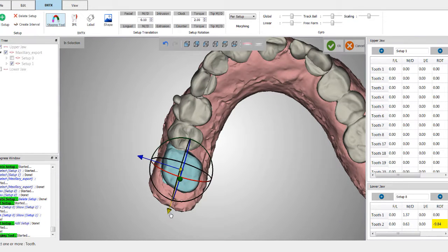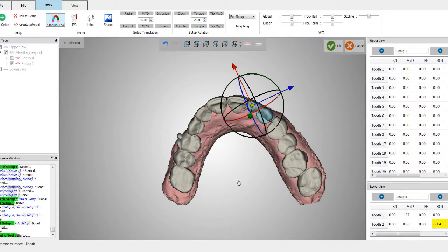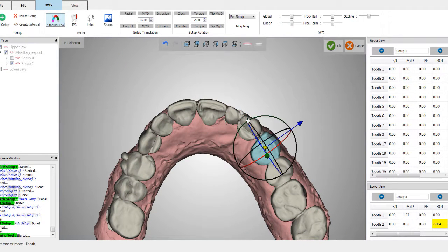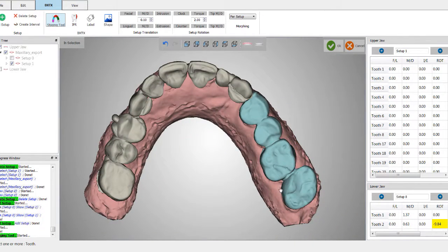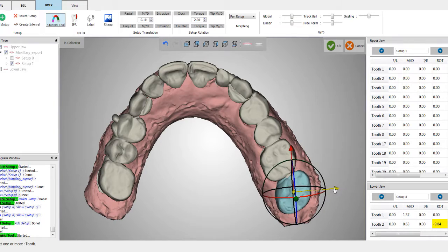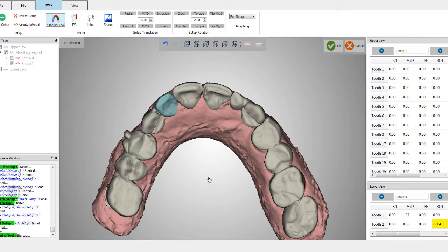Okay, getting back to space closure, I'm just going to bring these teeth together. Then on the other side, what we're going to do is take this entire segment here and bring this forward. And I'm going to bring this entire segment forward. I'm going to take this molar, I'm going to move this like so. And move that mesial just a little bit. Just take an overall view of the case.